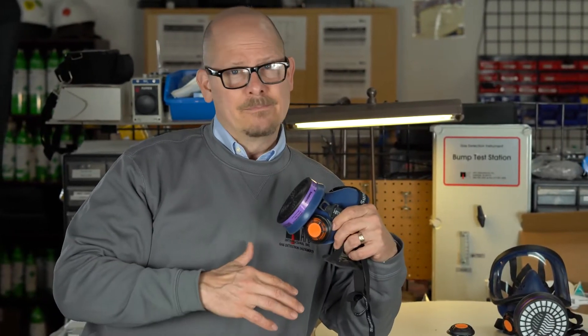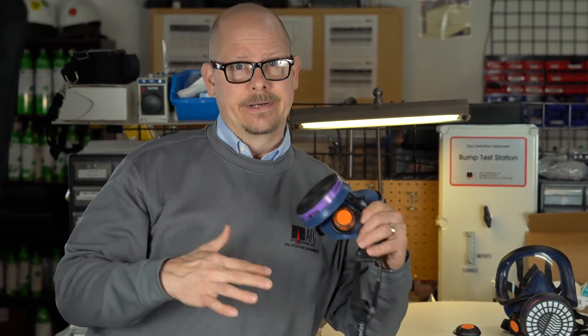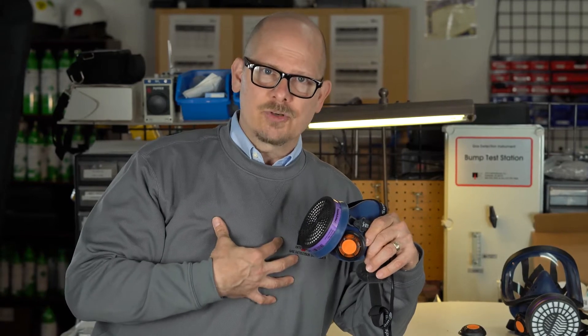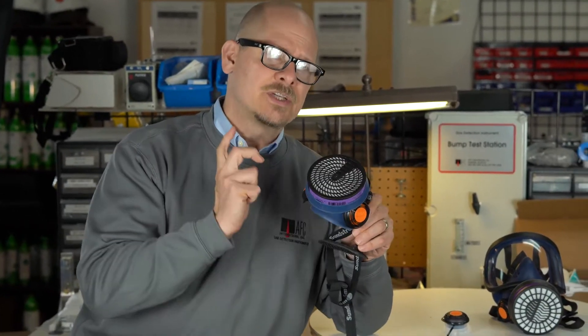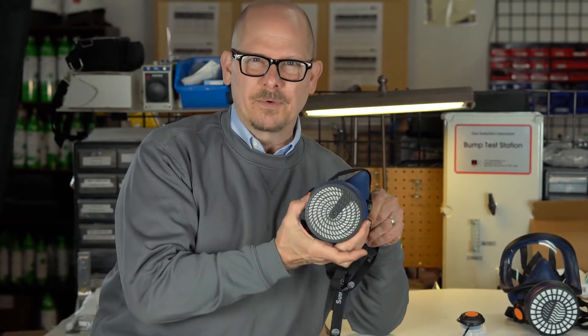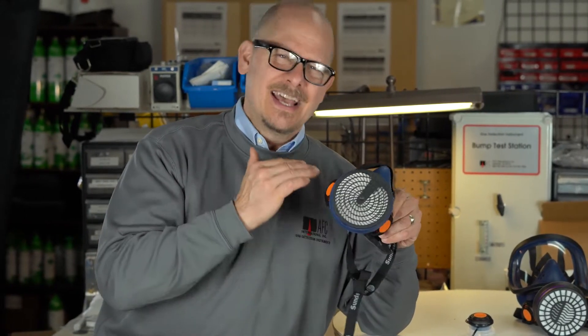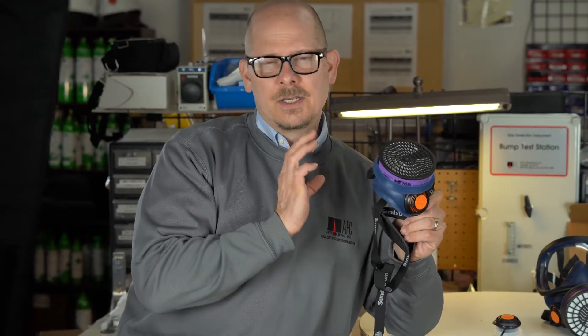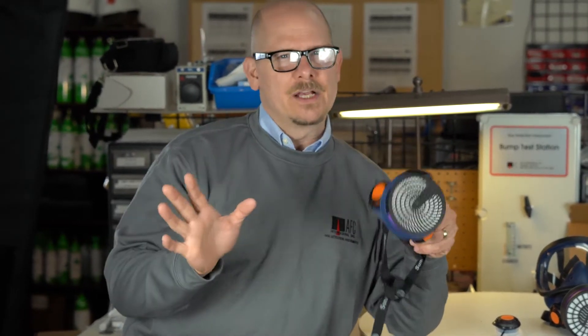If you're wearing a mask — and a lot of people lately have been wearing masks for a long time — you get stressed, your body gets stressed. So the dual exhalation valves really come in handy. Plus you can see on the Sundstrom it's got a huge opening, so inhalation is very easy and exhalation is extremely, extremely excellent with this mask. Head and shoulders above anything else on the market.